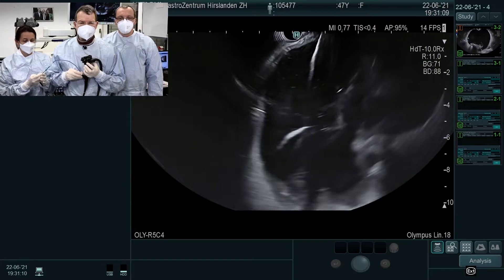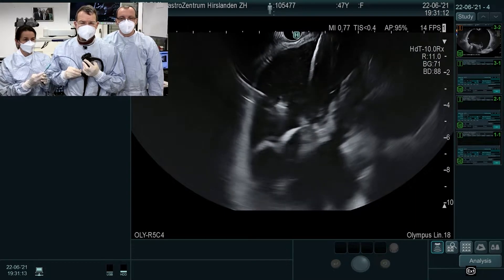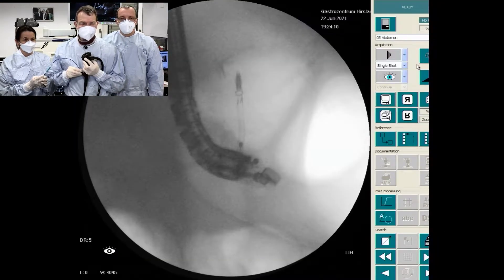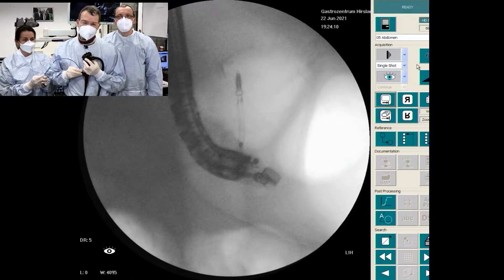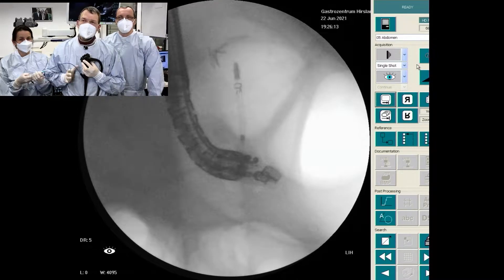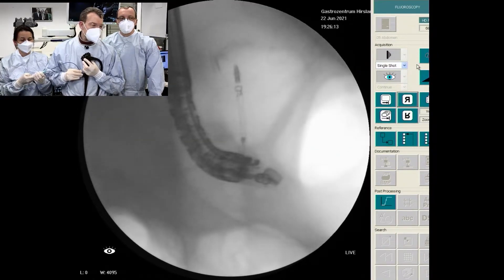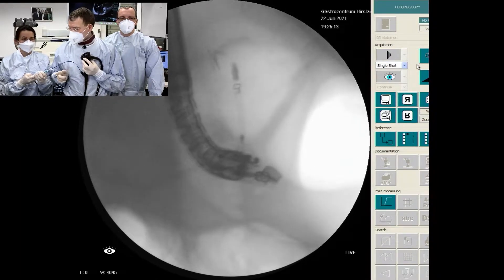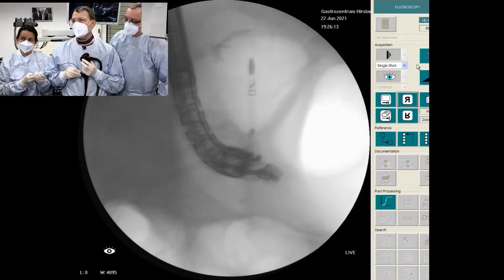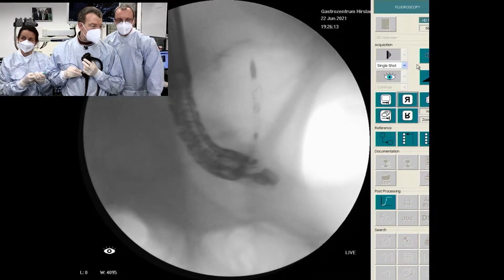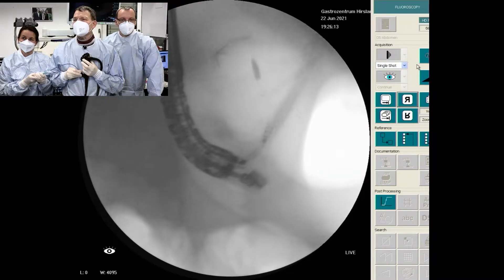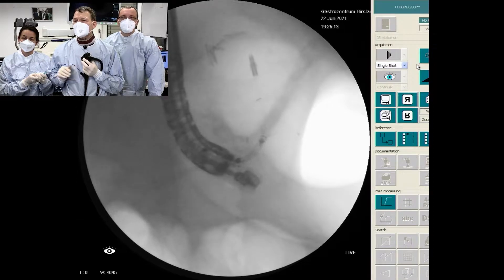You can appreciate that the system is now in the pseudocyst — you can see this on the endoscopic image. We are switching to x-ray. We would like to demonstrate the delivery by x-ray, though actually x-ray is not strictly necessary. On the x-ray you can nicely see an outer and a center marker, and now Bozhena is delivering the inner part. You can nicely see how these markers are going to overlap and how the stent is going to deploy.